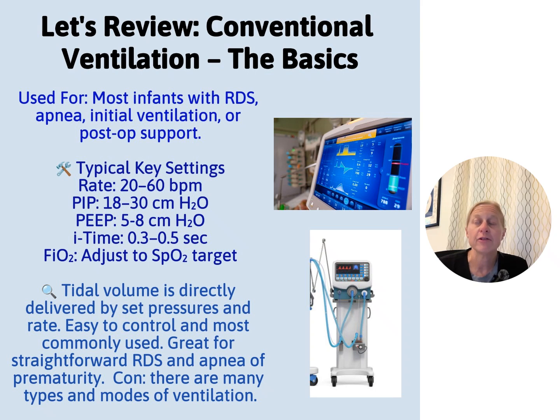I do have, from last June, a complete Teach Me Tuesday talking about different ventilation modes and what that looks like on blood gases. We break down the blood gases based on that in short videos. So go back on my YouTube page and look through that and you can find them. There are going to be new versions coming out soon, but if you need that today, I want to direct you back there. But let's talk about the conventional ventilator.